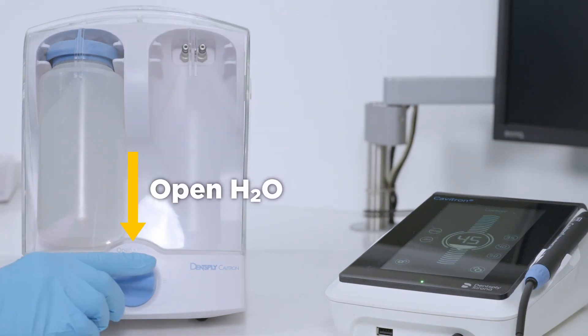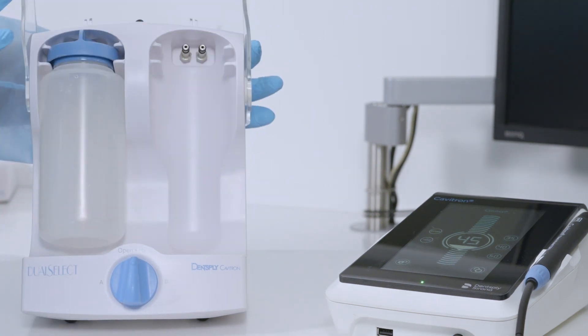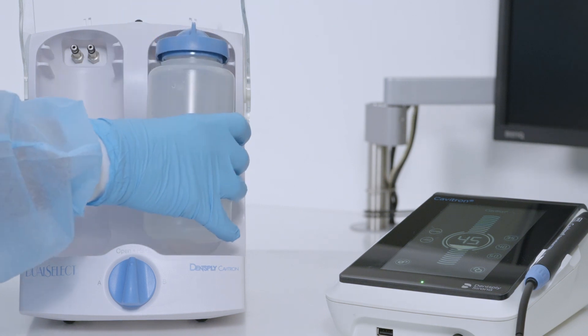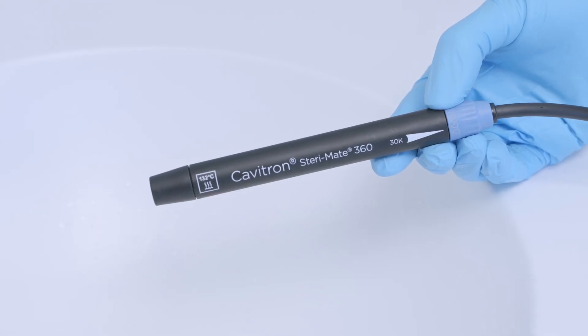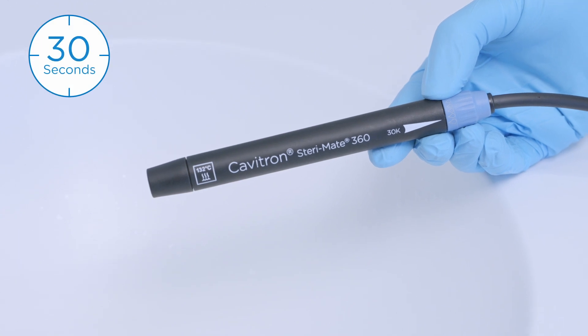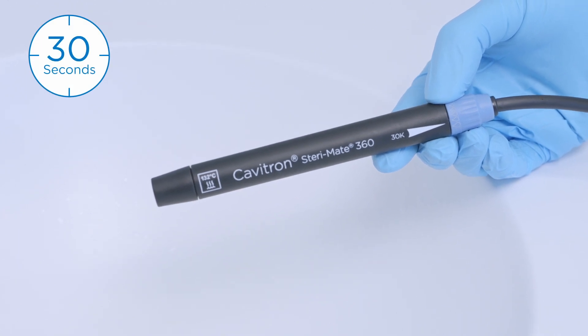Set the selector knob to open H2O position. Open the shield and remove the empty bottle from position A and place it in position B. Operate your Cavitron system at maximum water flow for at least 30 seconds to air purge the line dry.